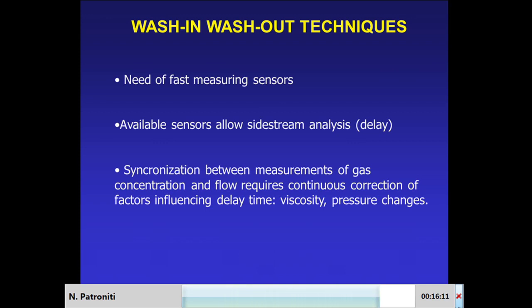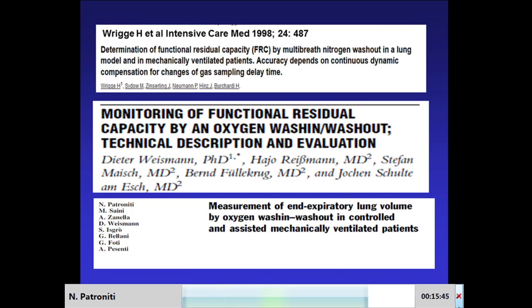The technology the ventilator or the system needs is not so easy, okay? Especially you need a very precise synchronization between the gas measurement and the flow measurement, because the mass you will compute is the multiplication between the two. There were many systems around.